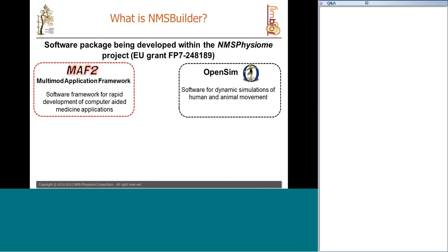The main aim of this project, from the software point of view, is to integrate the MAF application, which stands for Multimod Application Framework, which is basically a framework for computer-aided medicine applications, and the OpenSim software.